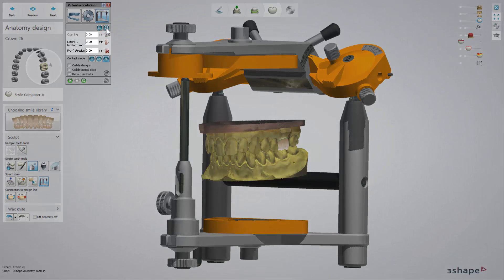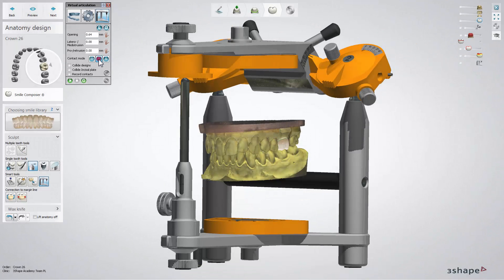In this window you can select the movements you would like to check and modify the parameters of the articulator movement. Click to prevent jaw penetration during the articulation and select Record Contacts. This will show you the contacts when doing movements.